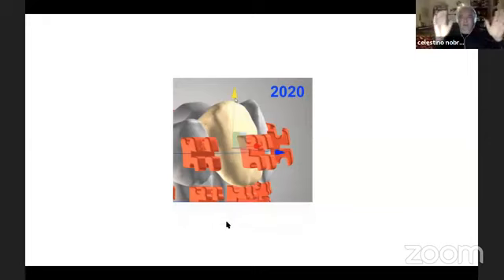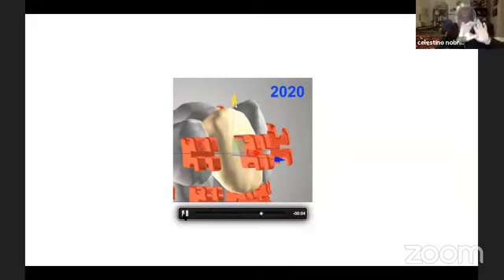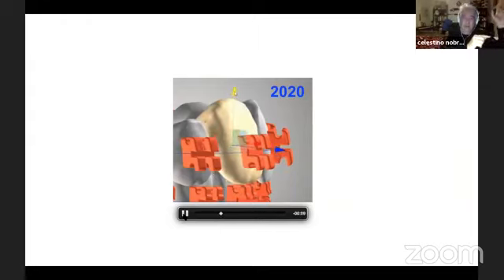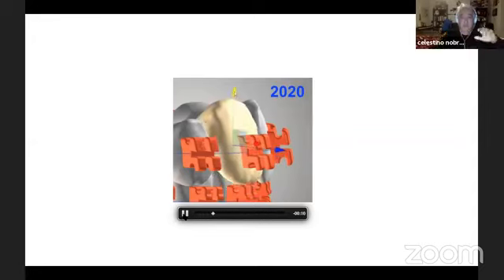I can have the crowns and the roots, and this is the perfect situation for my patient. After that setup, with the perfect position for crowns and roots, we can print the brackets in ceramic. This is not a drilling process but an additive manufacturing process, printing, not milling. It's different, a very interesting concept.